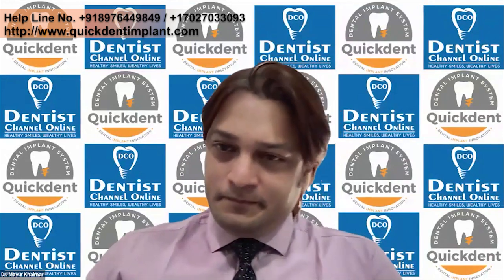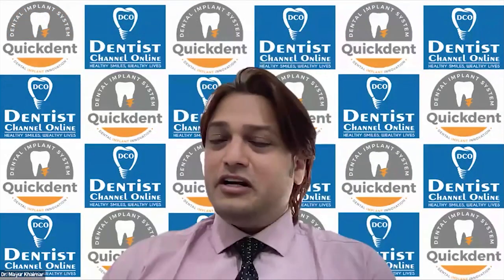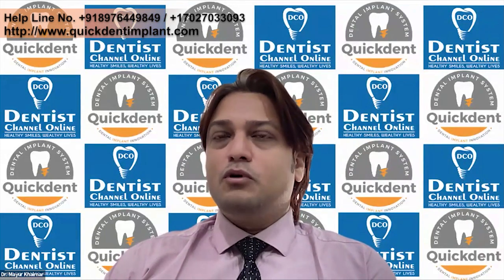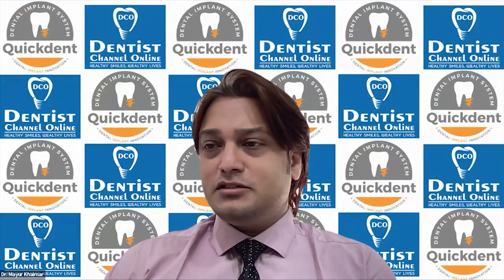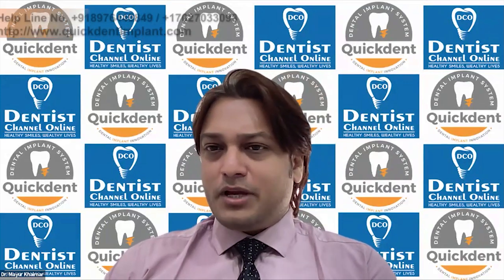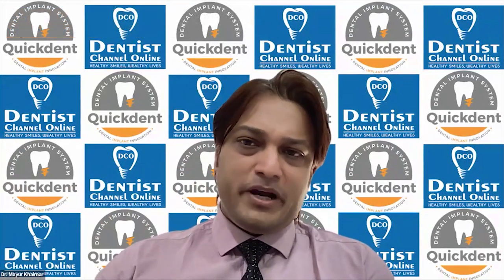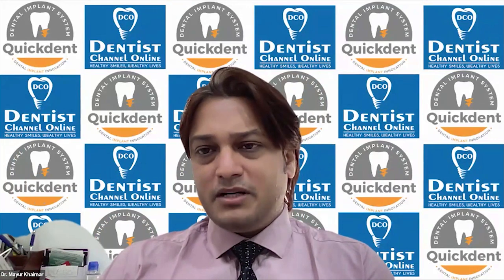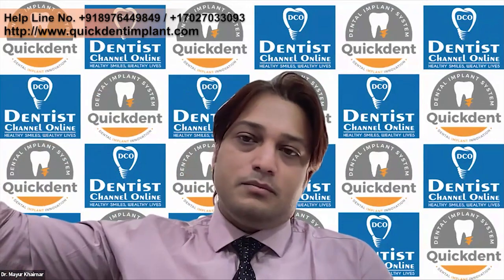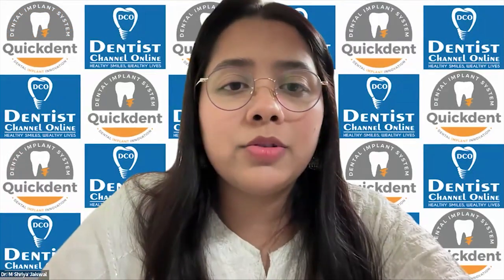Next one is immediate loading with PMMA and fracture chances. Definitely, it can fracture, but that's why I recommend going for more retrievable options, so that if it fractures, you just remove it and then replace it. Last week we replaced one case where it was fractured on one side. We removed it, sent it to the lab, and they repaired it. That's the best part of such hybrid prostheses: it can be repaired intraorally, or sometimes taken out of the mouth and sent to the lab, and they can repair it.